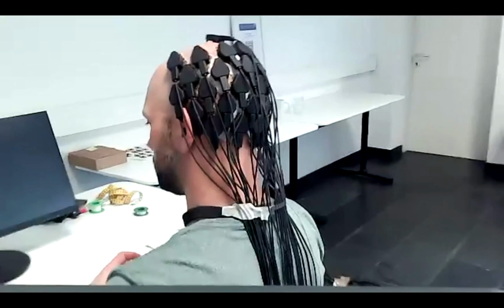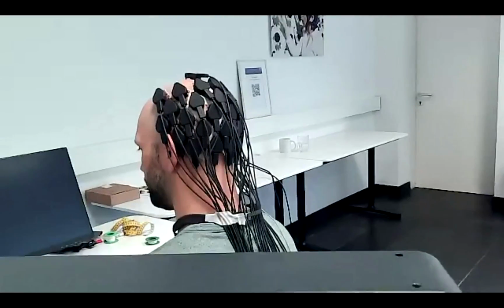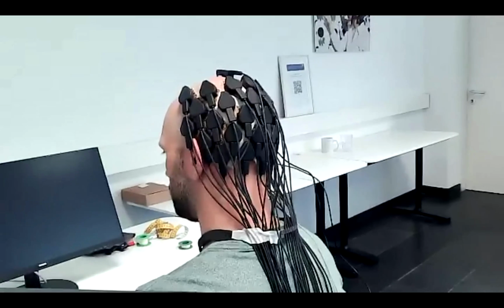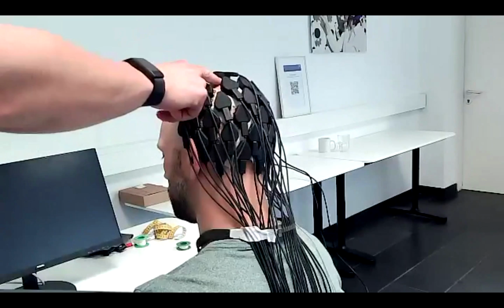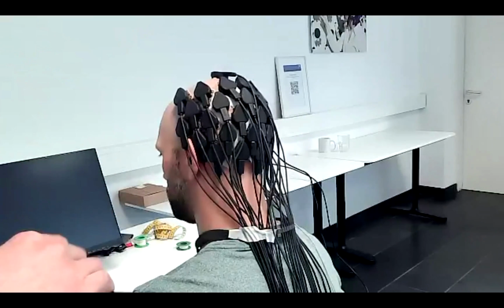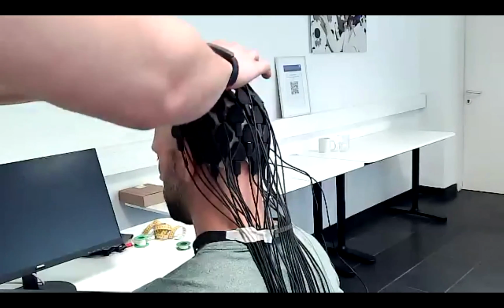Leo, there's one question. What can you do if the impedance is too high in one of the channels? In general, you need to make sure that the setup is properly done so the grids are attached nicely. You can also work with a little pen or one of those little sticks to check the data quality and then attach channels and grids manually. When you set up the whole system by applying the grids, you should make sure that all the grids are attached nicely to the skin. So you can tap a bit on it, like I'm doing now.